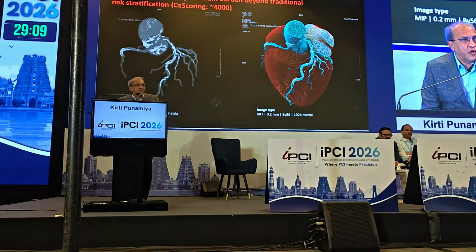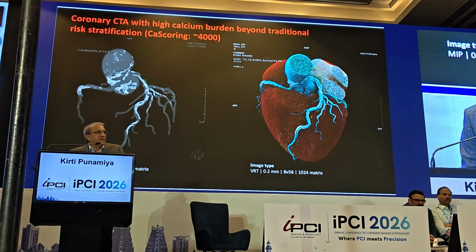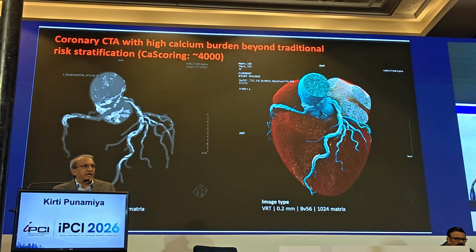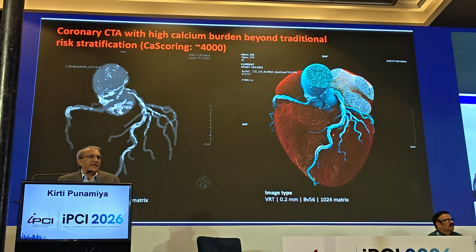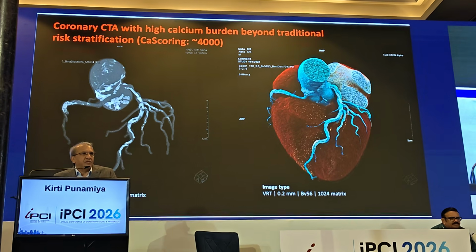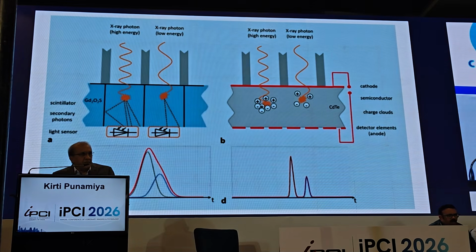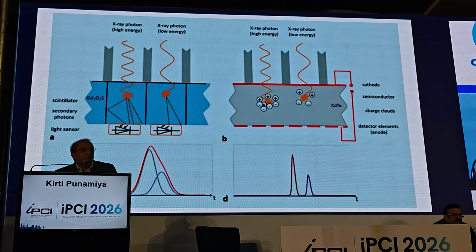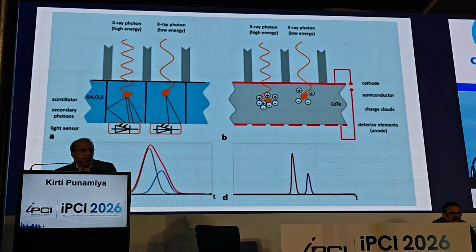You and concept. I will also show you that in different levels of calcium, you can actually differentiate dense calcium from not so dense calcium, which is difficult to otherwise differentiate by just the naked eye. The difference is very simple: cadmium telluride comes as a semiconductor, and it's a crystal that gets incorporated.